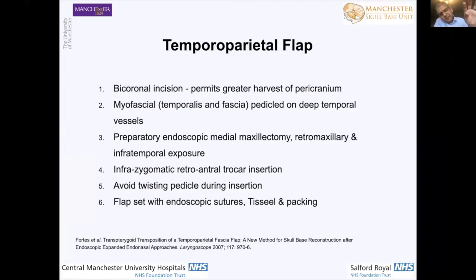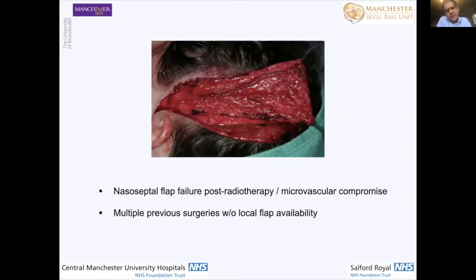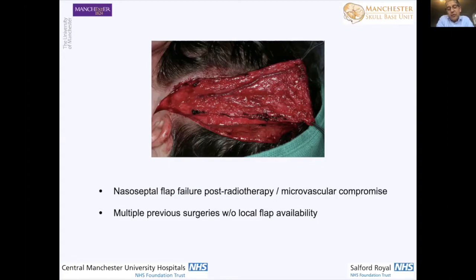The distance from the penetration point to the clival defect recipient site isn't very great. The important point is just to make sure that your pedicle doesn't rotate as you insert the flap. The sort of situation where you'd find this useful is when you've reconstructed with a nasoseptal flap but there's been failure because of radiation and microvascular compromise, or where there have been multiple previous operations and a local flap isn't available. This is a really nice, healthy piece of tissue to use.